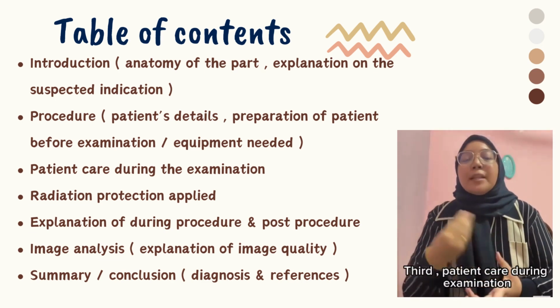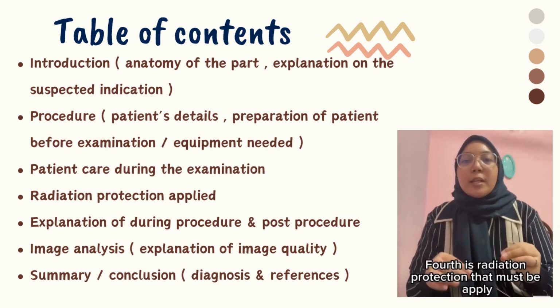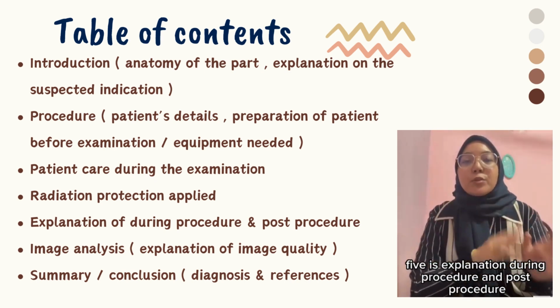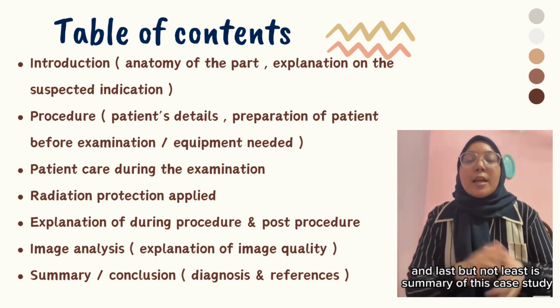Third, patient care during examination. Fourth is radiation protection that must be applied. Fifth is explanation during procedure and post-procedure. Sixth is image analysis, and last but not least is summary of this case study.